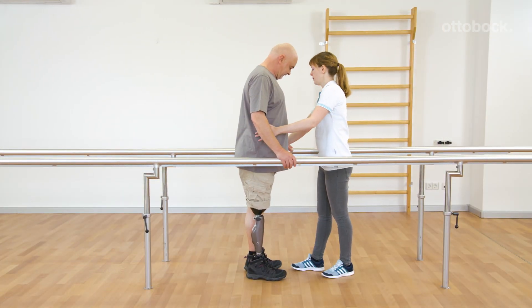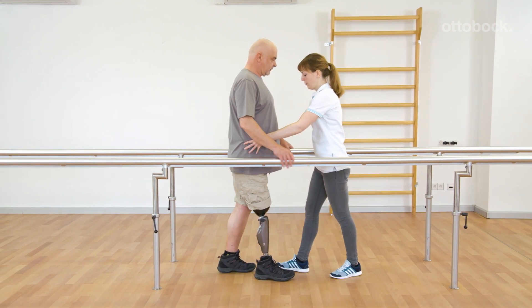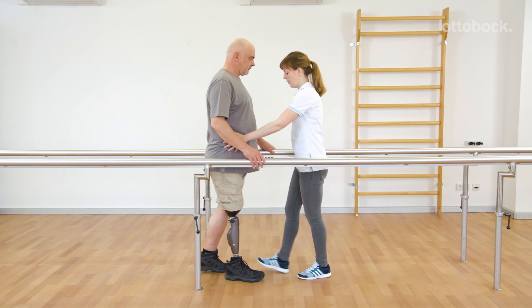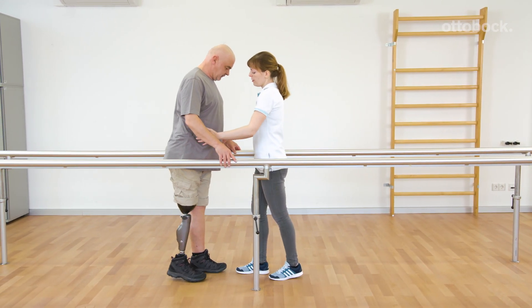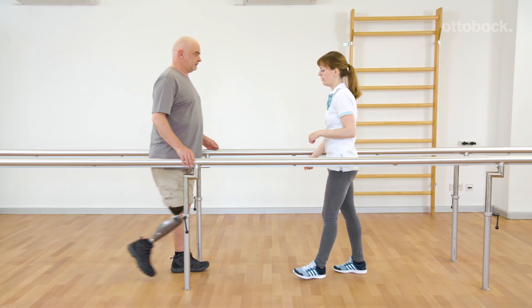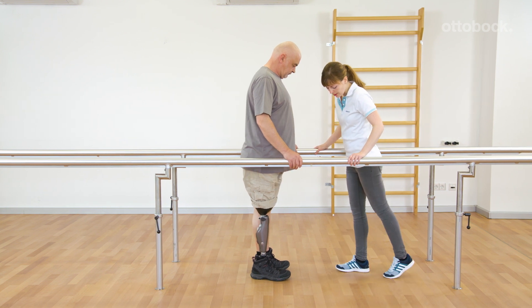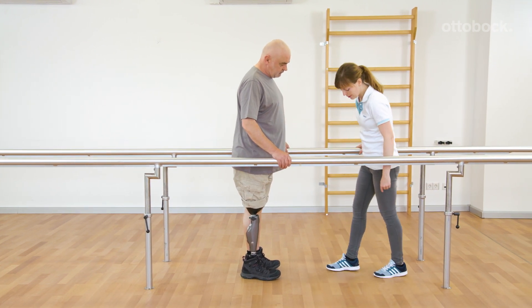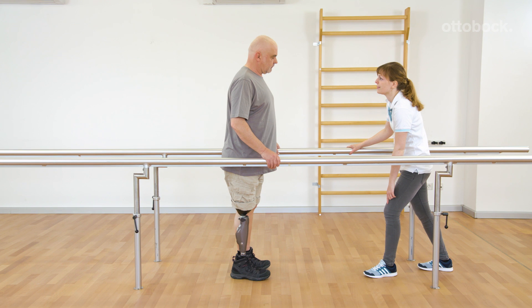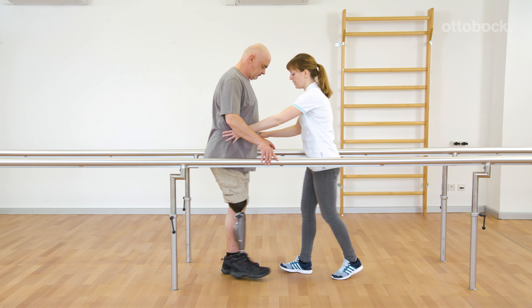Due to the embedded sensors in the knee joint, backwards walking is detected. Stance release is disabled during backwards steps. Franziska shows Gerhard an additional functional possibility of the knee joint: Gerhard can use the hydraulic stance flexion resistance while walking backwards to yield into knee flexion. Franziska slightly holds the prosthetic foot down to encourage knee flexion.